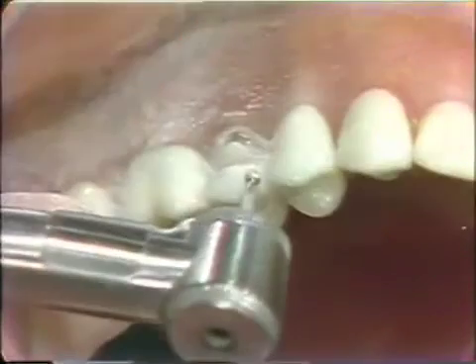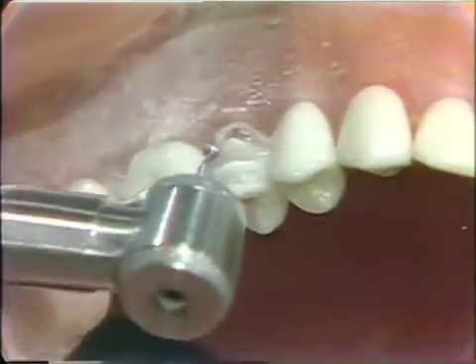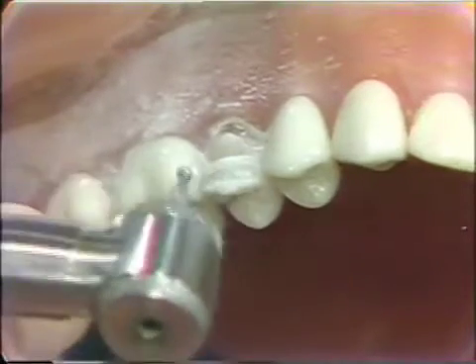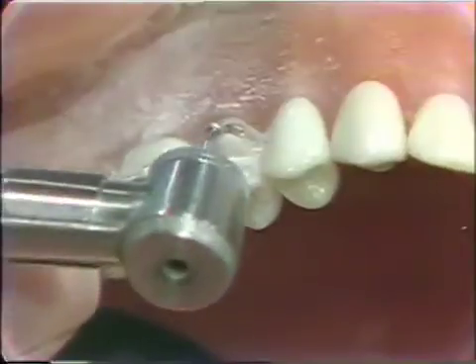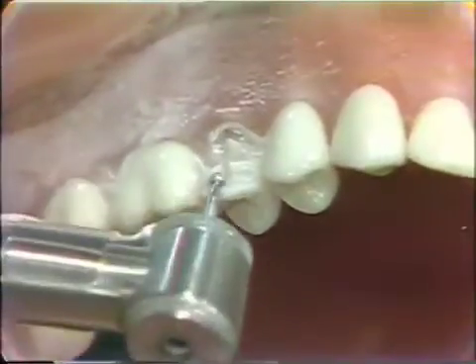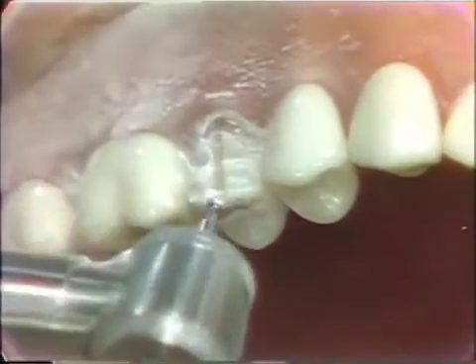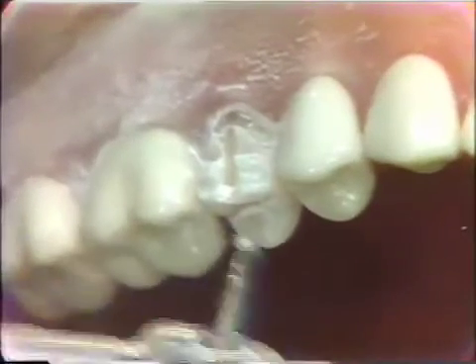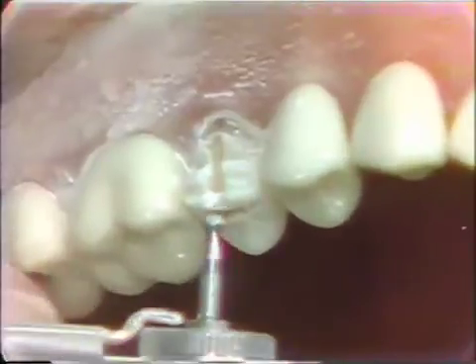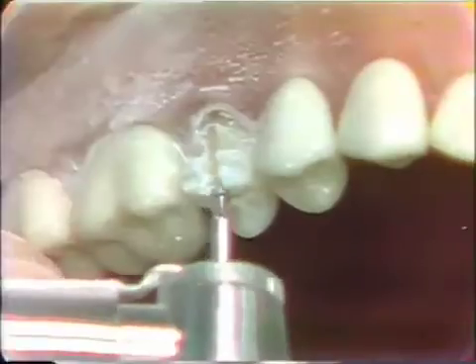Then we will make a cut across the incisal edge. In the bicuspid, where there is not as much room as the cuspid that we prepared, we will make one vertical cut to establish reduction in that axis. Then we will take the same diamond and run it across the occlusal surface.